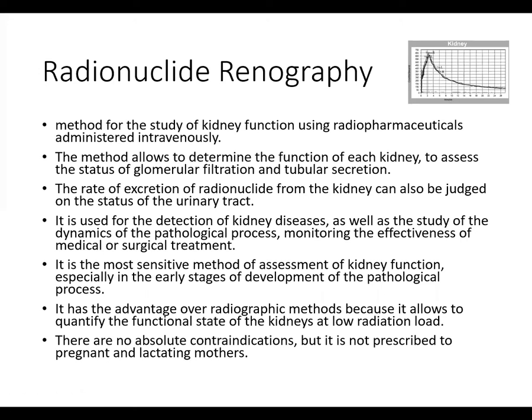This method we use for the study of kidney function using radiopharmaceuticals, meaning chemical drugs which consist of a radioactive isotope molecule and a special formula of the drug, which is administered intravenously.